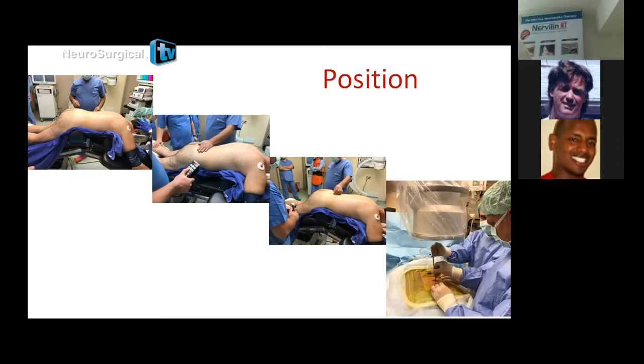Also, what Dr. Rutan told me: never think, okay, it's not rigid anymore, but I will do it. It doesn't work. He says, position the patient again, and then begin. Position is really important. When is your starting point? It's soft? It will be tight. Tight, very tight. That's your starting point, because that means the interlaminar window is widened and the ligamentum flavum is tight, so when you cut, it's easier. But when it's soft, it's really a big problem.